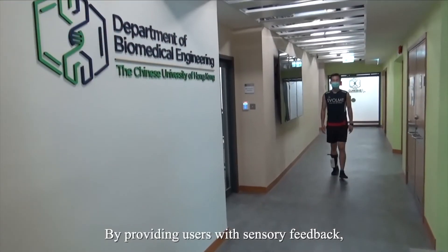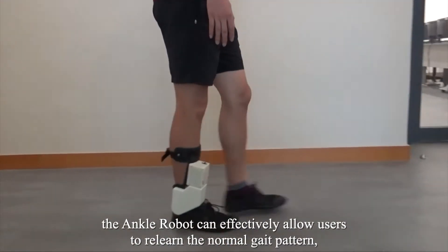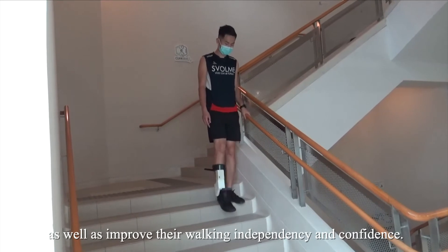By providing users with sensory feedback, the ankle robot can effectively allow users to relearn the normal gait pattern, as well as improve their walking independence and confidence.